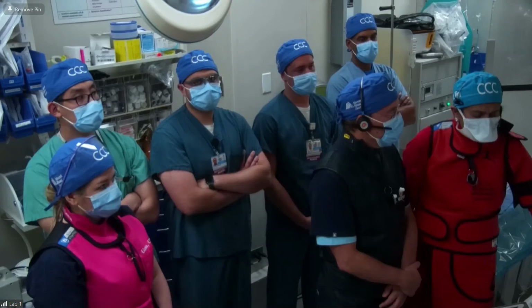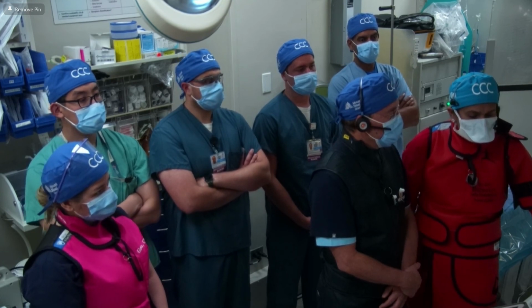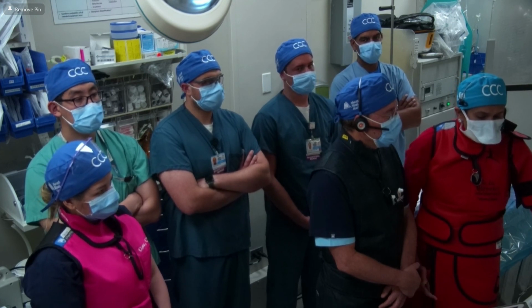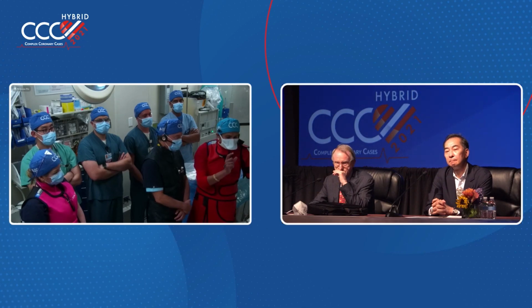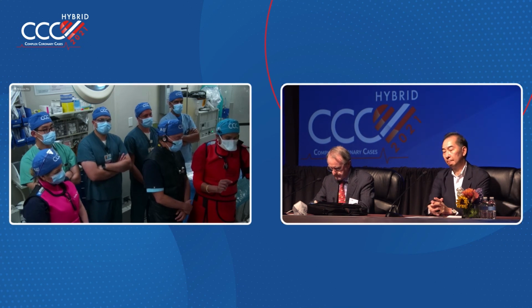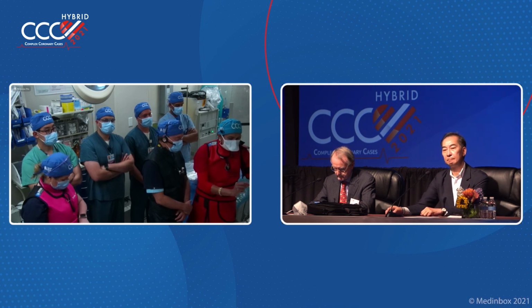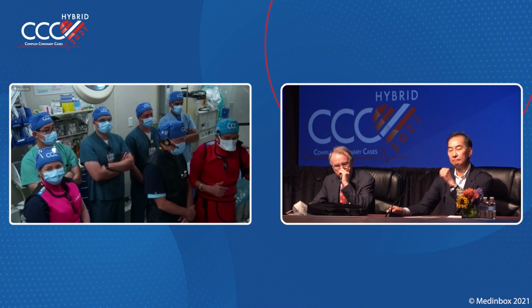Very important point by Dr. Kwan. If you are unable to cross the balloon, first thing you do is rewire. Then people do say do a POT, but POT is very important if you cannot wire. That means your proximal part of the stent is not well apposed. So POT is important if you cannot rewire. If you already rewired and the balloon does not go, you go to a different cell strut and then go with the same balloon. If it does not, anchor technique with a lower size balloon. All these steps are described in Bifurcate 3D and the original Bifurcate app.